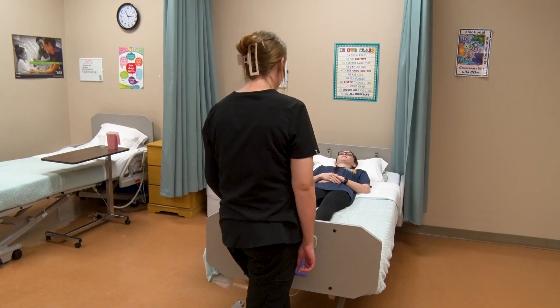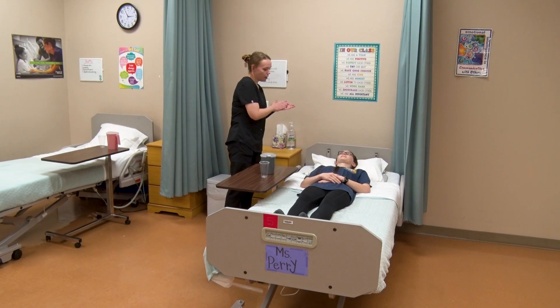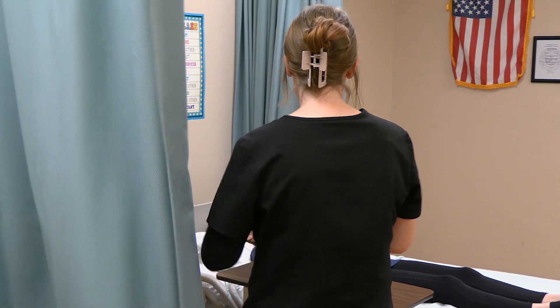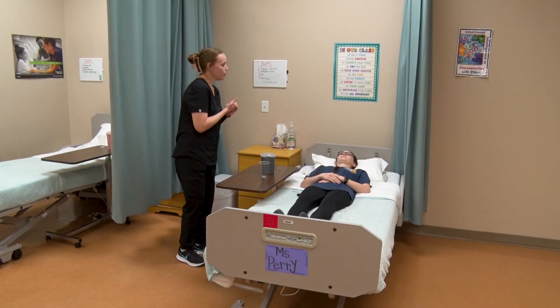Hi, my name is Haley. I'm going to be your CNA for the day. How may I address you? Hi, Ms. Sophia. I locked your bed. I'm cleaning my hands with friction till dry and I'm going to be closing your privacy curtain. Today I'm going to be ambulating you with a walker and a gait belt. Is that okay? All right, I will be back with my supplies.